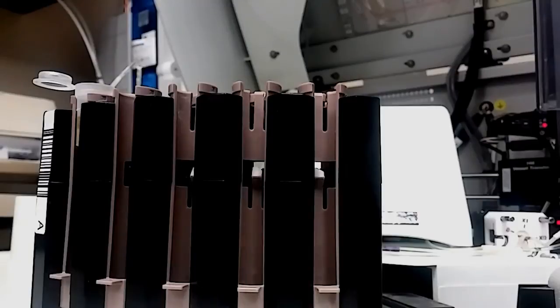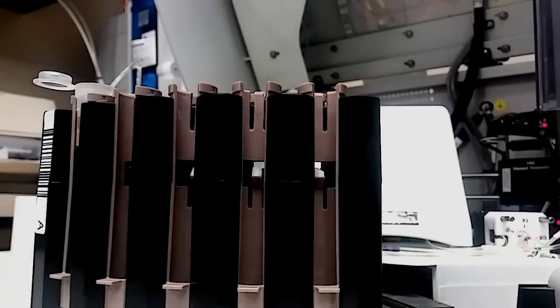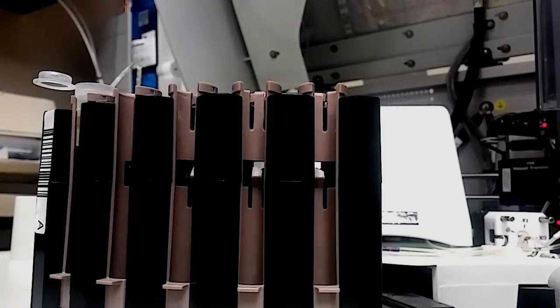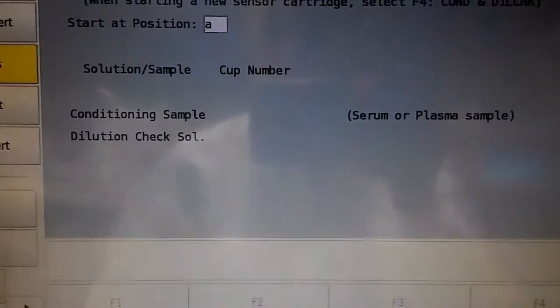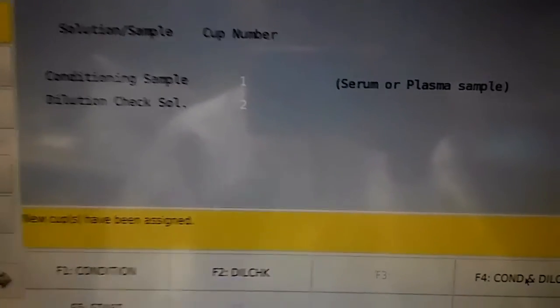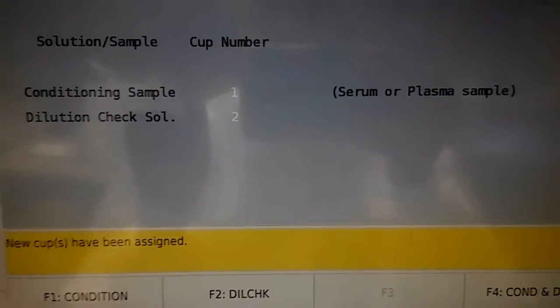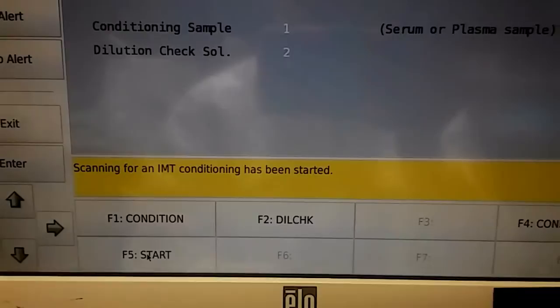So now I put the patient plasma in cup A at spot one, and in spot two I'm going to put the dill check on rack A. Now that that's done, make sure you close the lid and place it on the instrument. I start at position A1, then I press F4 because I want both the condition and the dill check — it'll show you that condition is in spot one and the dill check is in spot two. Then all you have to do is press F5 to start, and close everything.